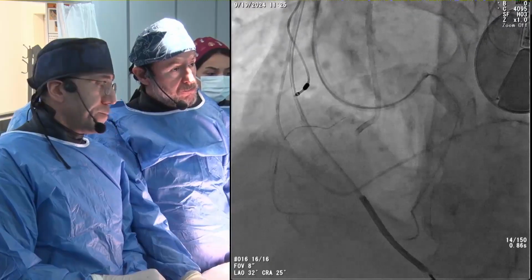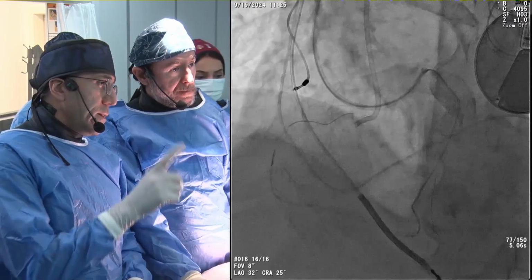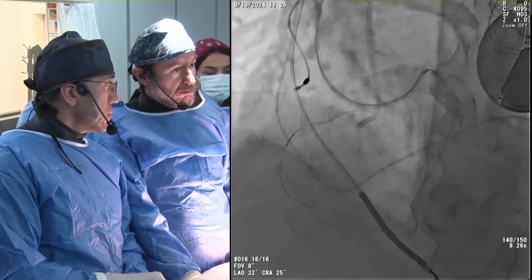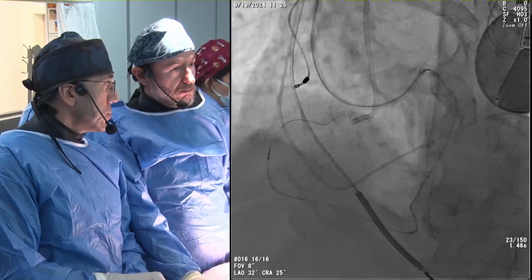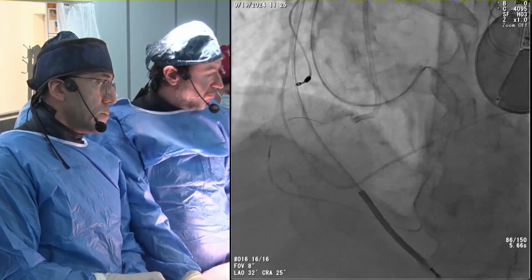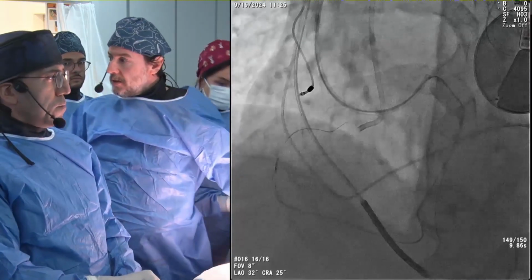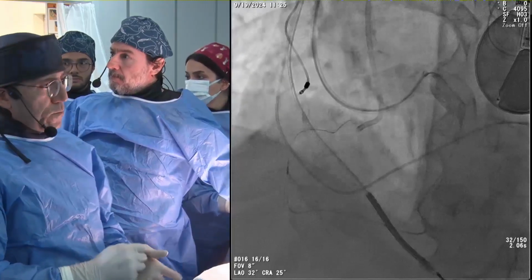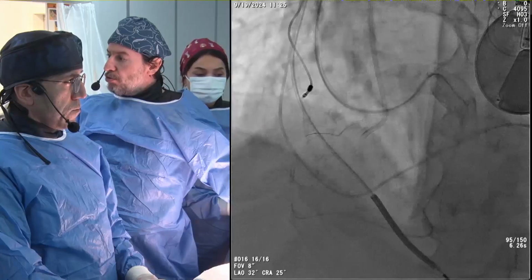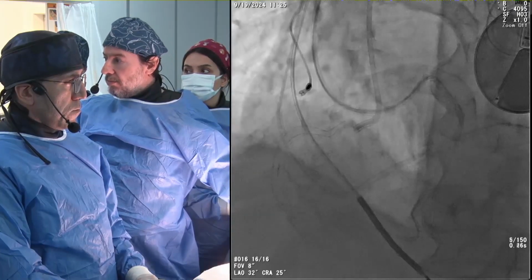I think we can do some Carlino from the retro and then take a conquest-like wire and try to penetrate, and maybe we can also change our catheter with a regular Judkins. Maybe it can come to the ostium. Anyway, it will show us. Sometimes it works. At this point, I think we will definitely need stiff wires like CP2, Hornet 14, or if it doesn't work, maybe we can take Astato.